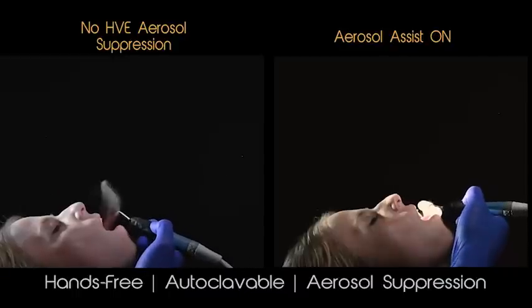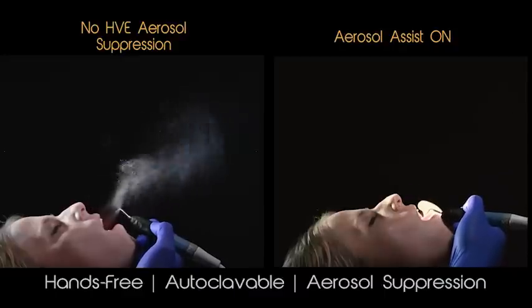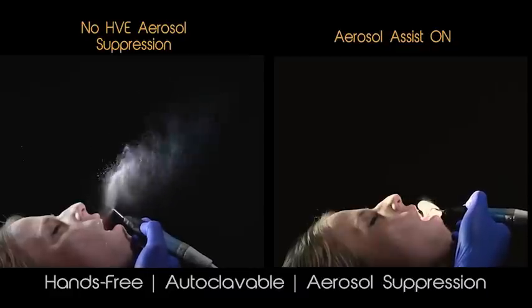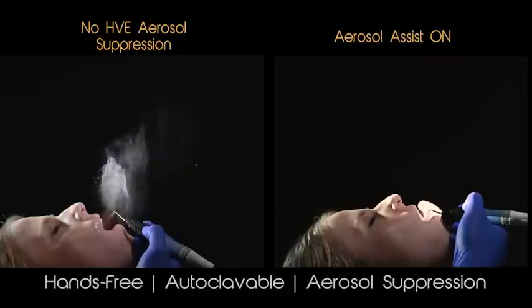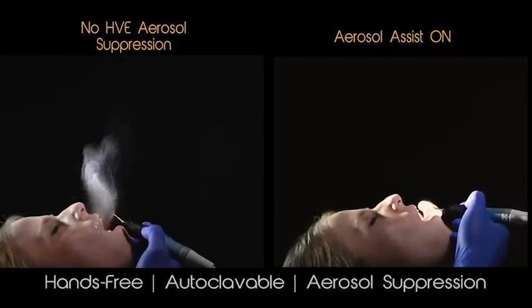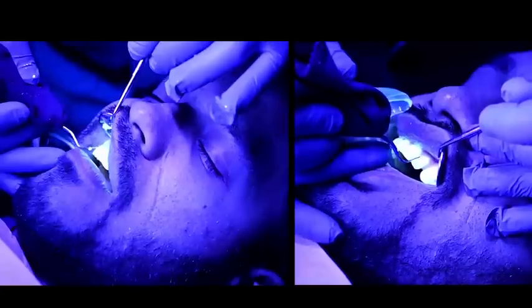What you see here is what we call aerosol visualization testing. The same setup is on the left and the right — the same lighting, the same scaler at the same setting — and we are benchmarking performance against the standard saliva ejector. Notice on the right, as we move the scaler around the perimeter of the patient's mouth, little to no aerosols are accumulated, with the few getting pulled directly into the device. On the left, the patient has more splatter visible and you can see the change of direction of those aerosols from the scaler as the patient breathes. This is something that is not easily visible to the naked eye with normal lighting.